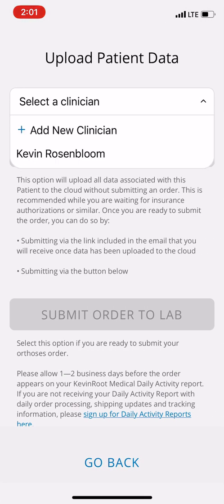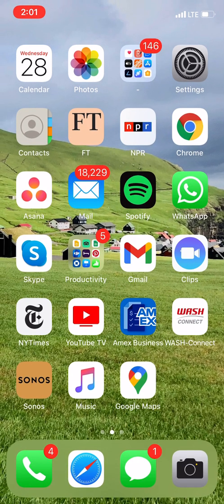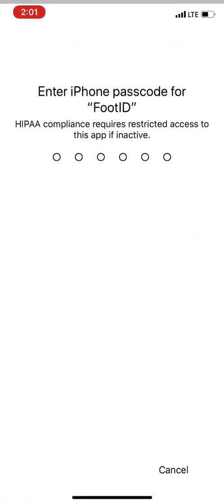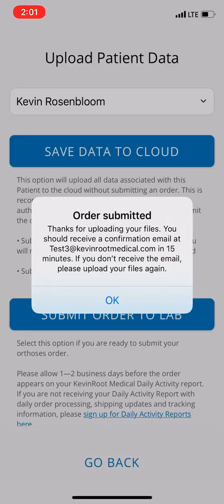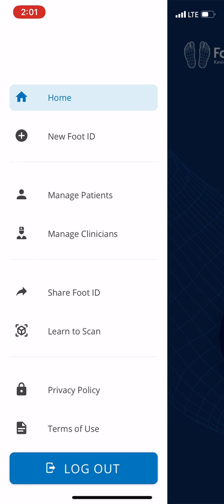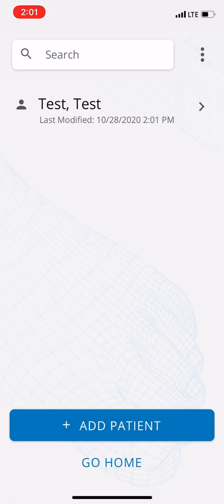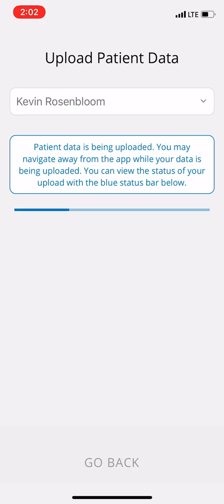Now we're going to upload this, select the clinician again, and submit the order to the lab. You can navigate away — that's not a problem — and then go back to the app. You're going to have to enter your passcode and you'll get a confirmation that the order has been submitted, plus another email confirming submission. Every time you go to this patient and want to submit another order, it will be like a fresh cast. You can continue to upload with new scans and new order forms as patients come in repeatedly or things change.